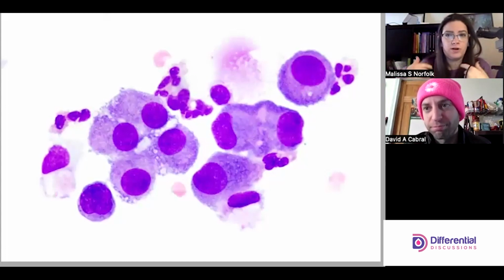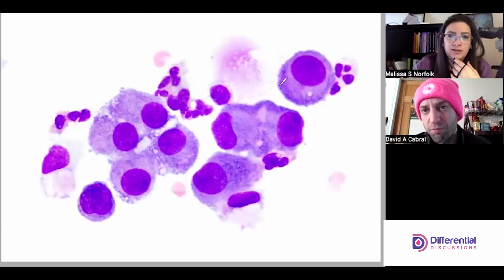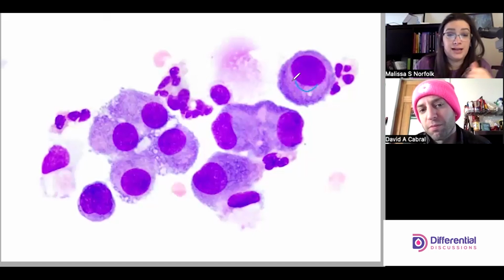For me that's one of the biggest things. Sometimes you see how the edges are darker here and the inside's a little bit lighter. If there were a perinuclear halo, and you still had the separation of color here, that could be a plasma cell, because sometimes plasma cells will have a little bit lighter on the inside next to the halo and then a little bit darker, especially when they're actively producing a lot of immunoglobulins.